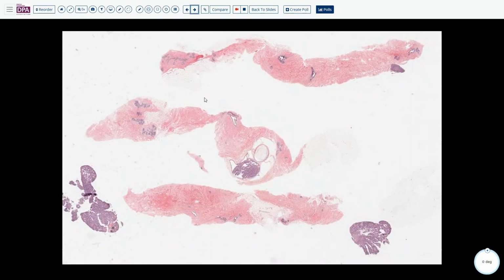Okay, and then for the first case, anyone want to take this case? I think for most of the cases you should know the diagnosis. Or if you don't know, you can just give me the differential, because in the first slide I already gave you most of the diagnoses.